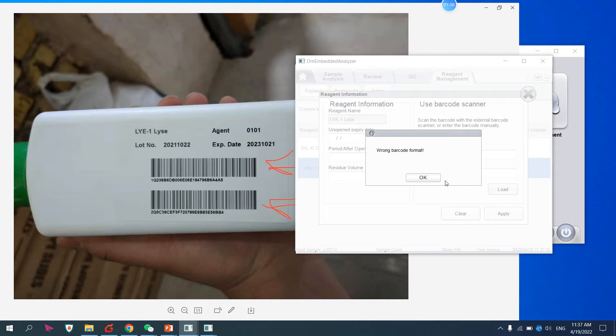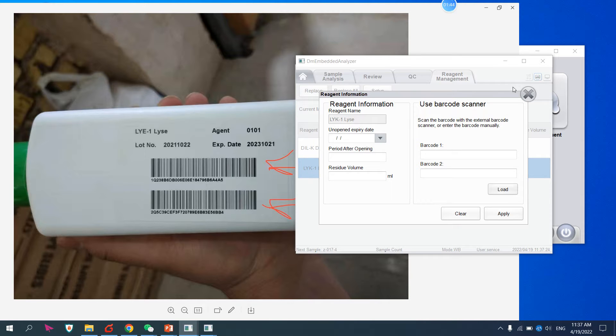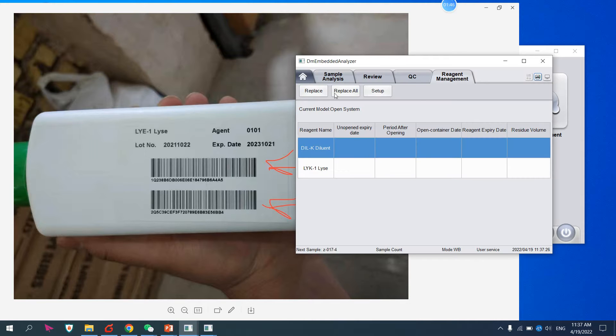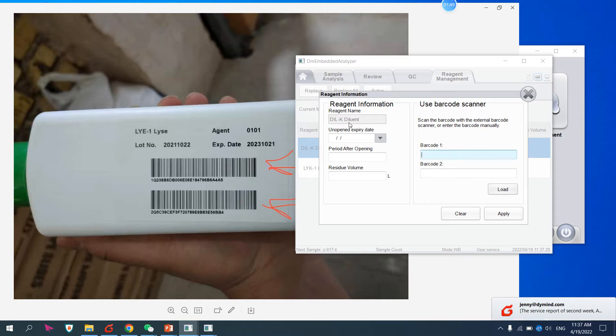Then you have to load it. When you load it, it will automatically update. Remember this is for Lyse 1. So we have Lyse 1 and diluent setup.